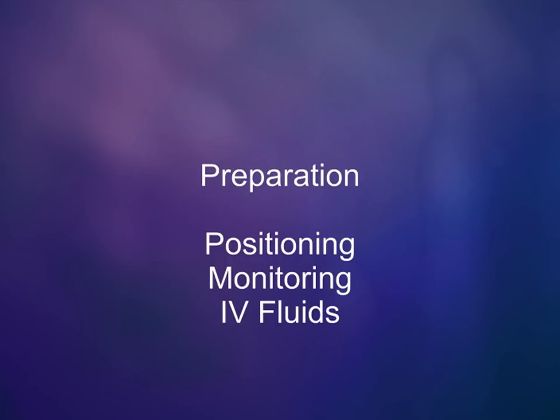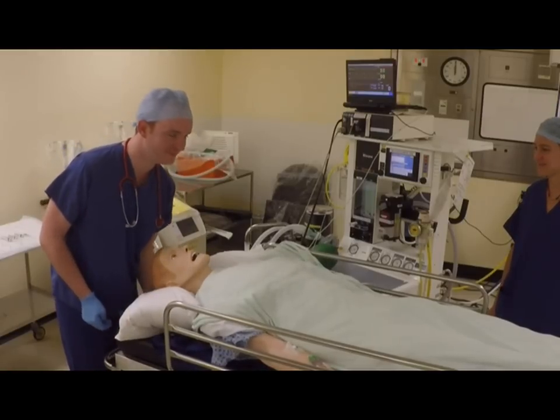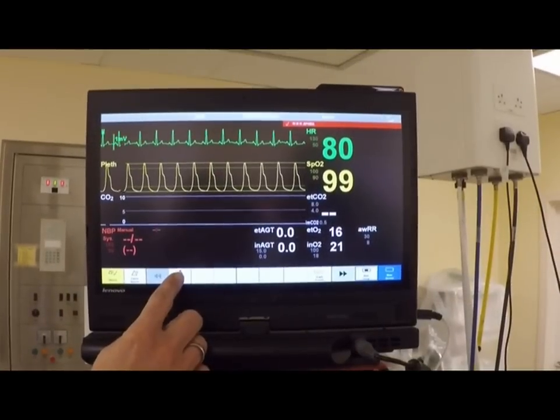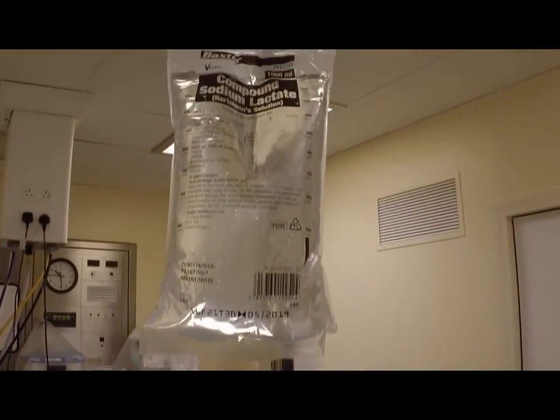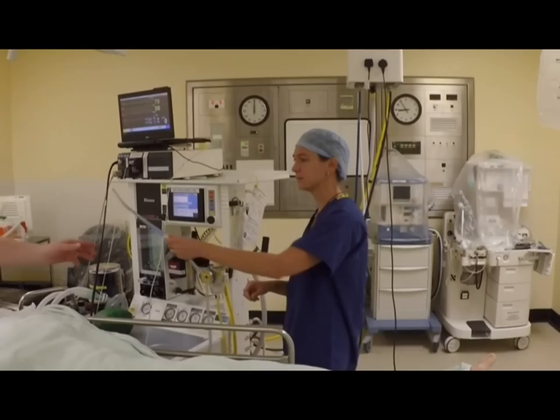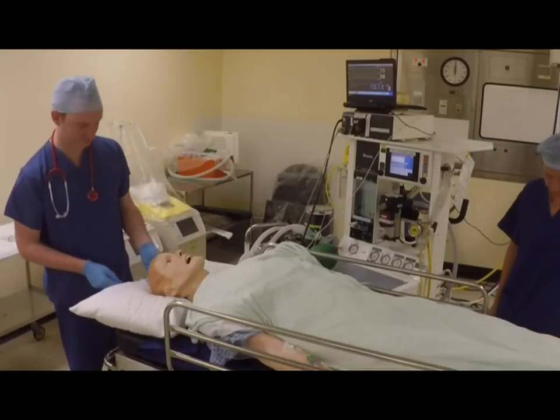The patient needs to be placed into the optimal sniffing the morning air position in order to facilitate the process of intubation. Monitoring should be attached, including ECG, oxygen saturation and blood pressure, as well as the availability of end-tidal carbon dioxide. Intravenous access should be established with fluids running. Suction should also be on and placed under the patient's pillow, ready to hand and close to the patient. A third person is also required to act as a runner in the event of critical incident to get help.